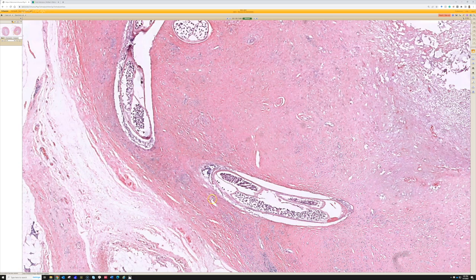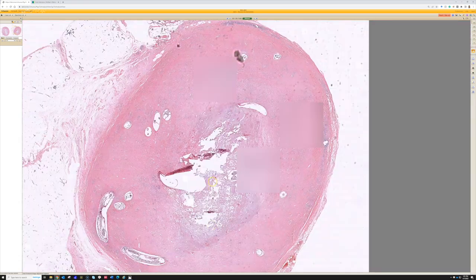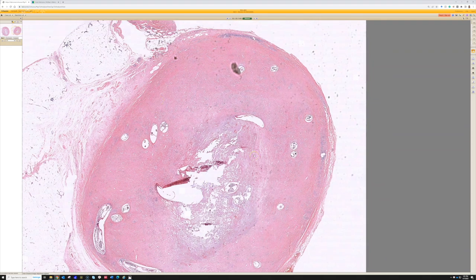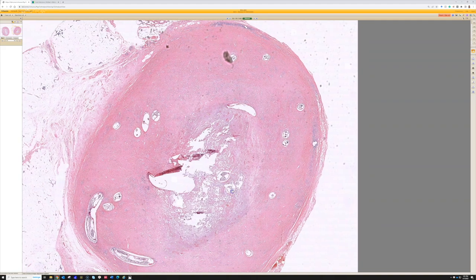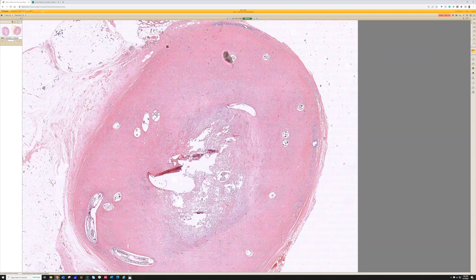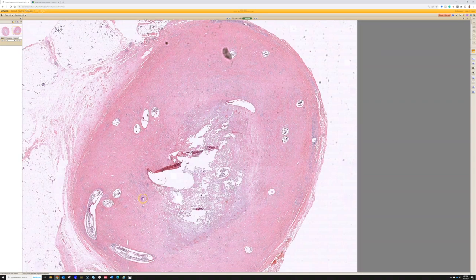In the background there are a lot of eosinophils and various amounts of reactive change. If you see something similar in North America and the patient has no travel history, consider the dog heartworm (Dirofilaria), which can sometimes infect humans. It cannot live long-term in humans and instead the worm gets into the subcutis or sometimes the lung, then dies and the body cases it off — producing a similar-looking nodule surrounded by fibrosis, inflammation, fibrinoid necrosis, and granuloma.